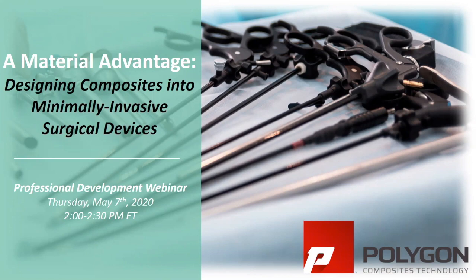Before I introduce our speakers, let's briefly touch on the type of composites we will be discussing today. As many of you know, a composite is made of two or more materials with different physical and chemical properties that, when combined, produce a material with unique characteristics from the individual components. Composites can be produced from a wide variety of materials and processes. For the purpose of this presentation, we're going to be focused on continuous fiber and thermoset resin composites.